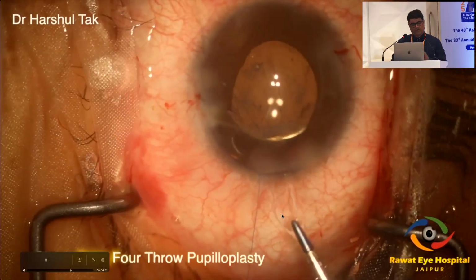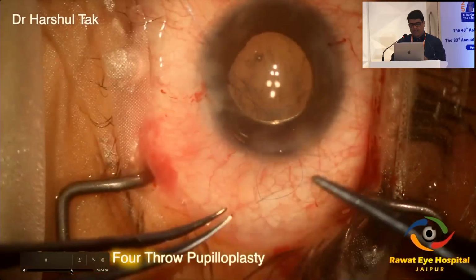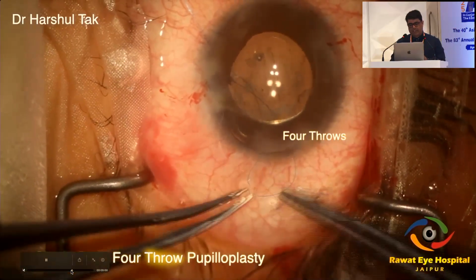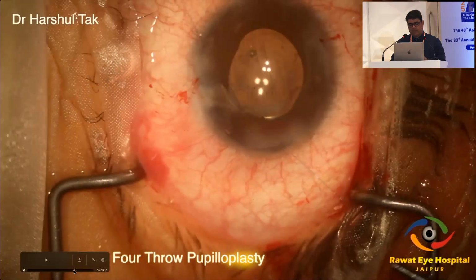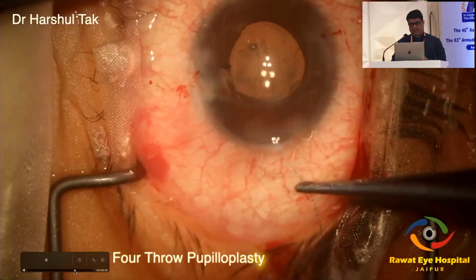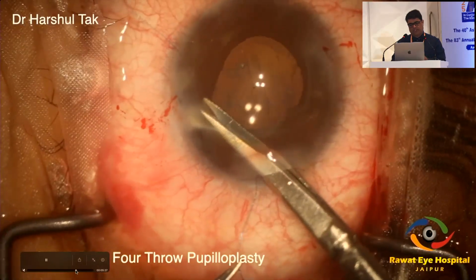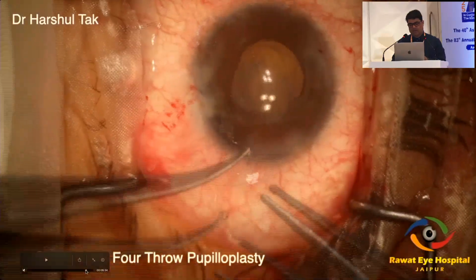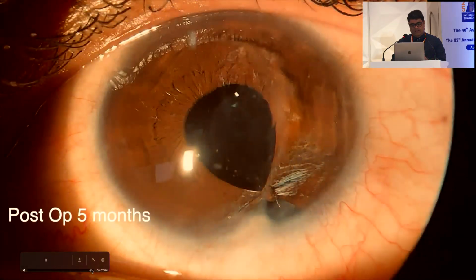Once you take out this loop, you give 4 throws of this Prolene suture, and then you just pull both the ends and your job is done. It's very simple. So just pass 4 throws and you tie a knot there. Depending on the iris defect, you can go ahead and do it 2-3 times. Again, I'm passing one more round there. So in the end, you have a pupillary iris defect which is closed nicely.